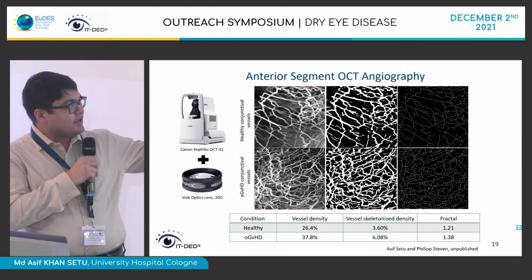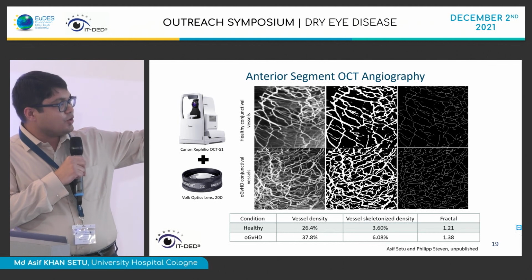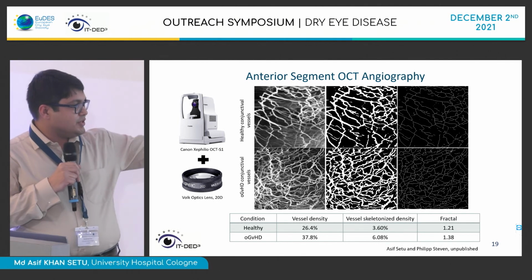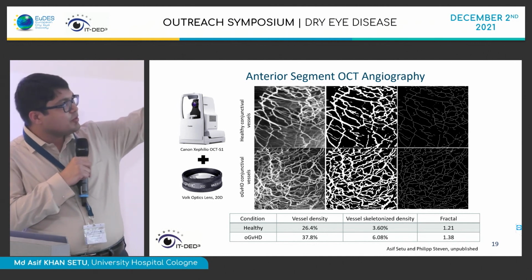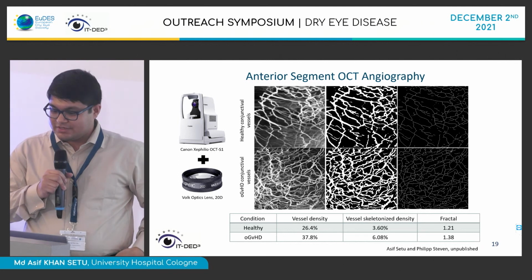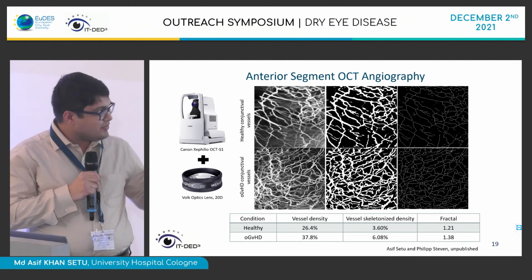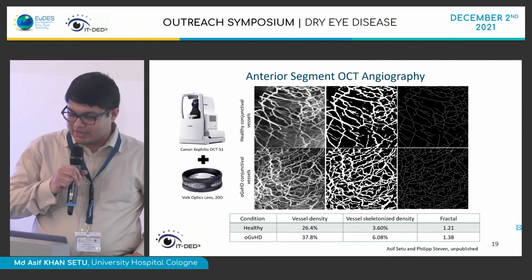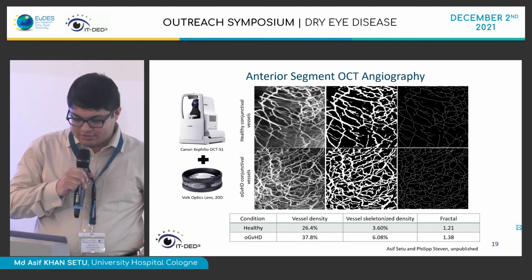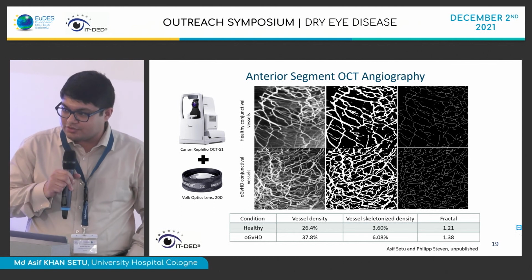We tried first to image using only the Canon, but at first we didn't get very high-quality images. Then we used extra optics on top of the lens, and we got good-quality images. However, the device was only there for 3 months, so we cannot get enough data for validation of our software. Hopefully in the future we could do that again.